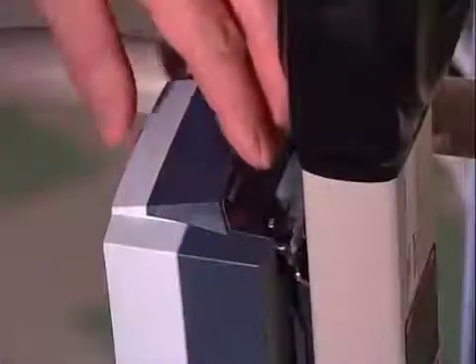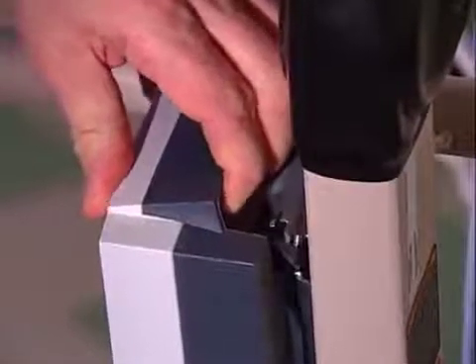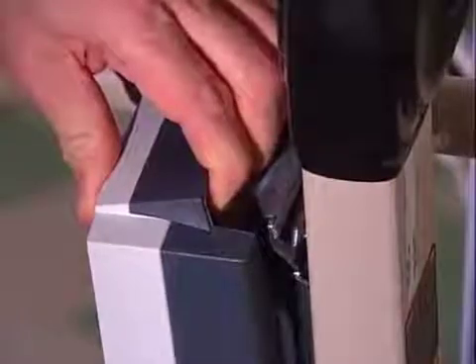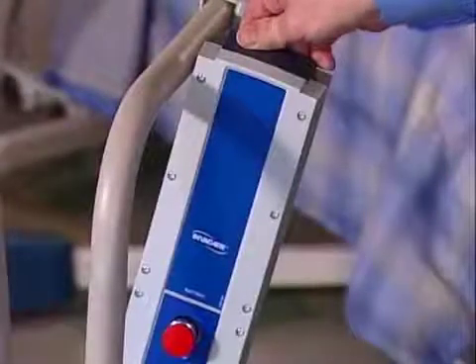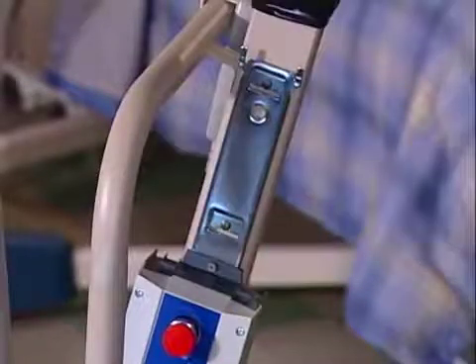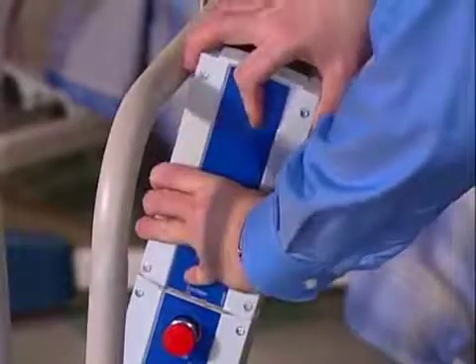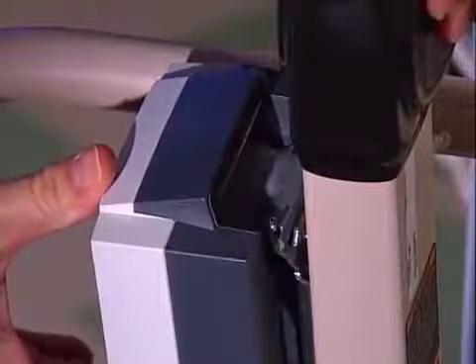First, squeeze the handle here on top. This will unlock the battery from the mount. Pull the battery towards you to clear the bracket, then lift the battery up and towards you. You might find it easier if you use two hands for this part. Mount a fresh battery by sliding it along the bracket until it rests in the cradle. Then push it away from you until you hear it click into place.